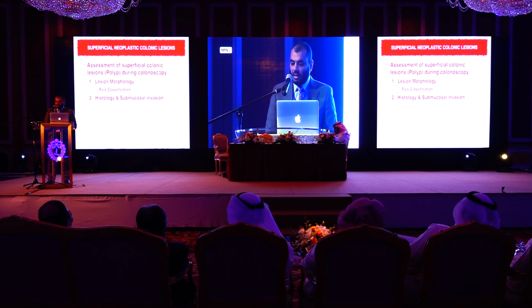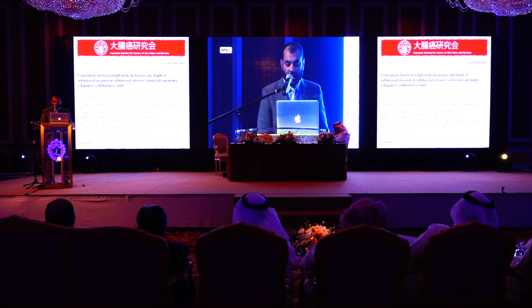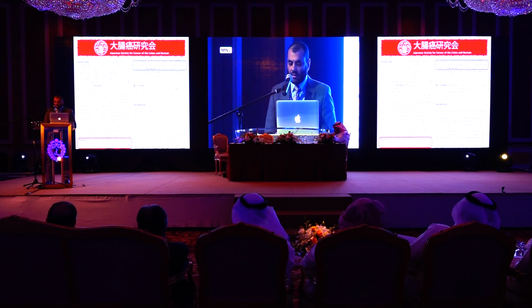The second item in the lesion assessment is the real-time histologic prediction and the assessment of submucosal invasion. This is very, very important. This is the main core of my lecture, and I think this is the most important slide in my talk. This is a collaborative study done by 10 universities and institutes in Japan, which concluded that the rate of lymph node metastasis is 0 in pedunculated lesions if the depth of vertical invasion is less than 3,000 microns, and in sessile ones if the depth is less than 1,000 microns.